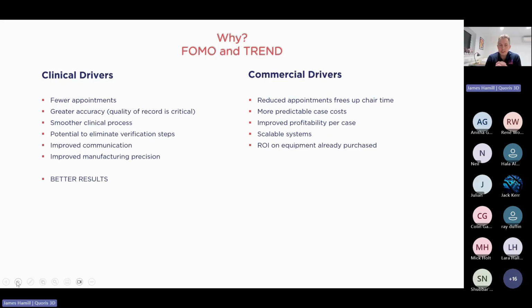And what I will show you in DigiBridge, 3 out of the 4 pathways do not have a verification step required now, simply because of the types of records and the way that they're taken. Certainly as well, we've got improved communication. Digital workflows allow labs and dentists to communicate better. There's less scribbled notes on soggy wet bits of paper that come in with impressions. And via email and screen sharing, etc., things can be much more easily communicated. So this is very, very important, and it's a big advantage of digital workflows.